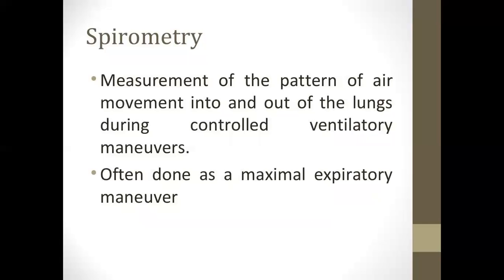Spirometry: measurement of the pattern of air movement into and out of the lungs during controlled ventilatory maneuvers. Often done as a maximal expiratory maneuver.